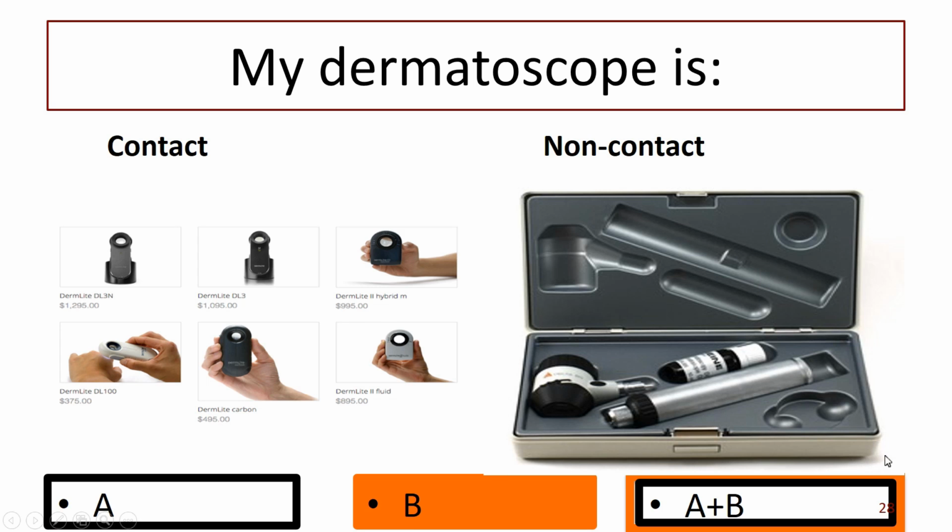Brilliant. My dermatoscope is A, B, A plus B, or neither. Now remember, those of you who don't have a dermatoscope are supposed to be doing this. Why is it that I always have to remind people of that? Okay, so quite a lot of you don't know. So I'd say there are fewer people marking that one than there should be.